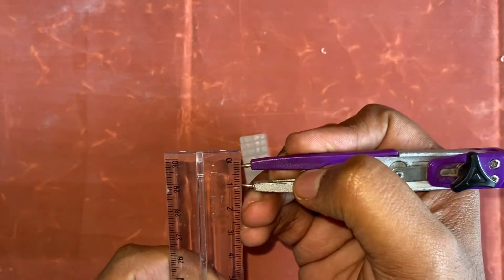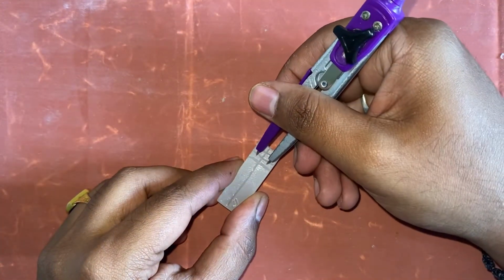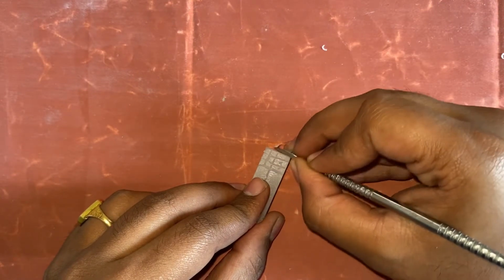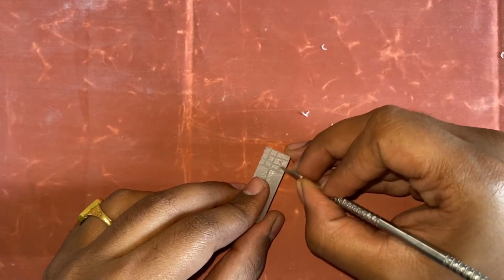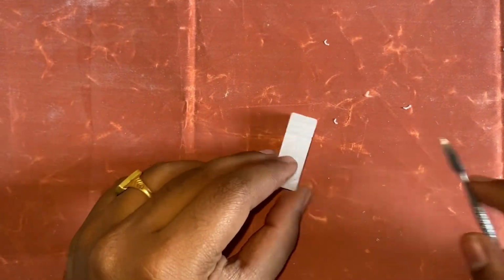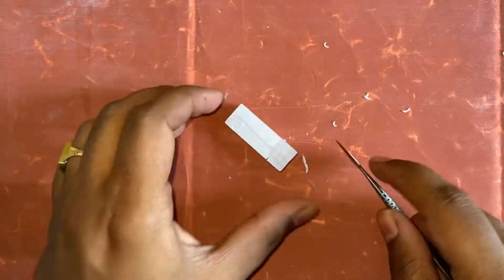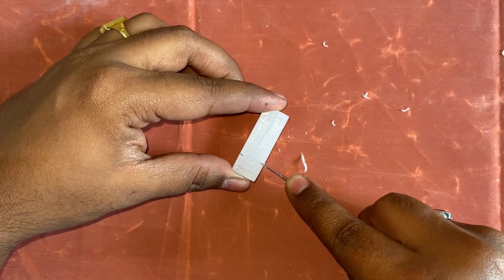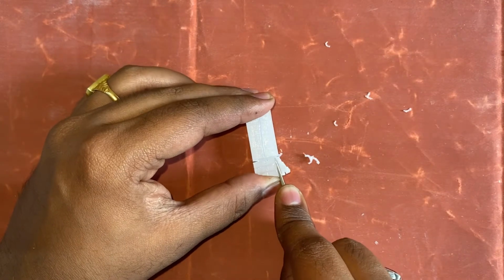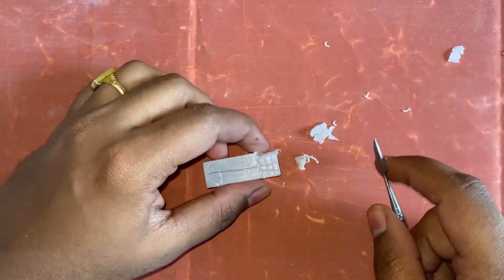Now again measure the buccolingual diameter of the crown, that is 6 mm. Mark it on the wax block. Now with the help of the carver, make two small cuts on the sides and then remove the excess wax to get the desired dimension of the crown, the desired length.